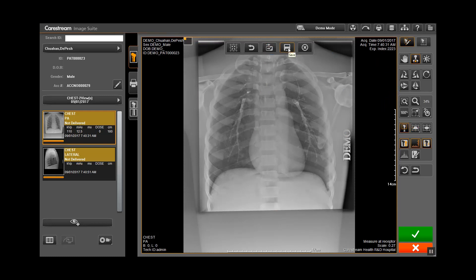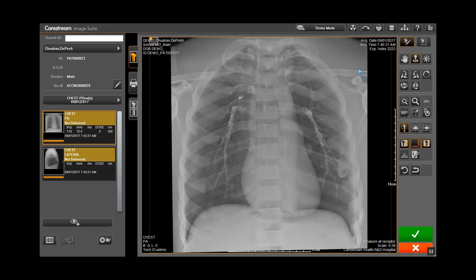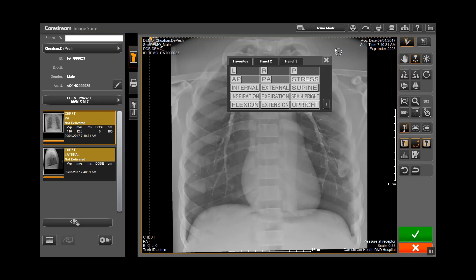To add a marker, click on the icon called Markers. Then click on the image and a menu will pop up of available markers.